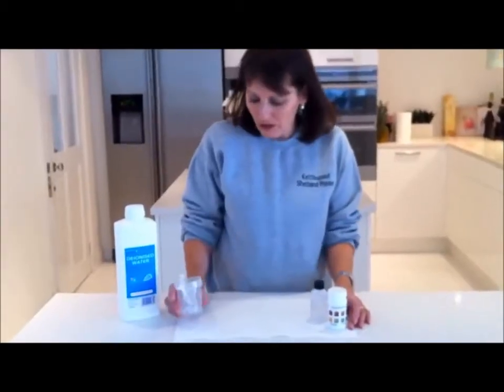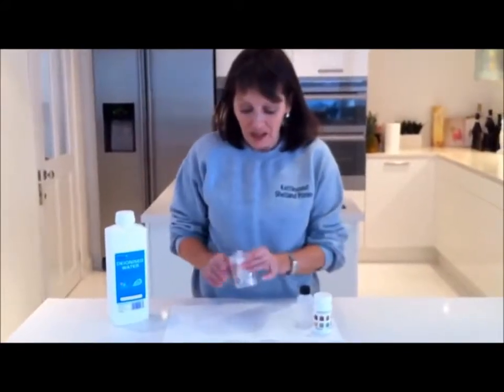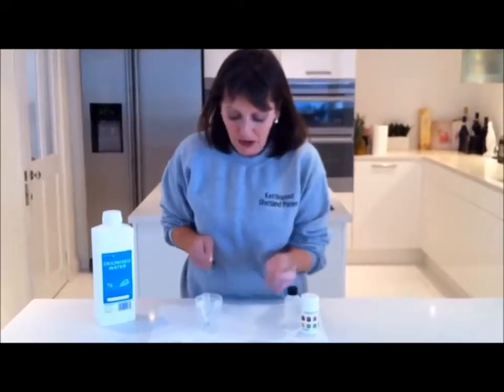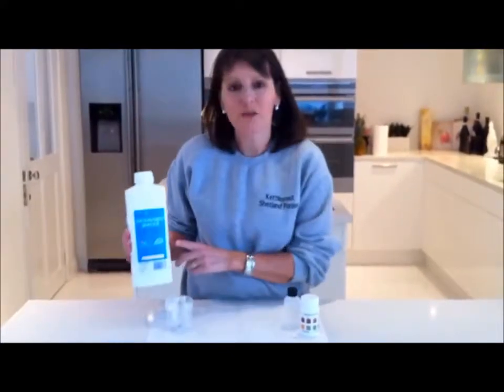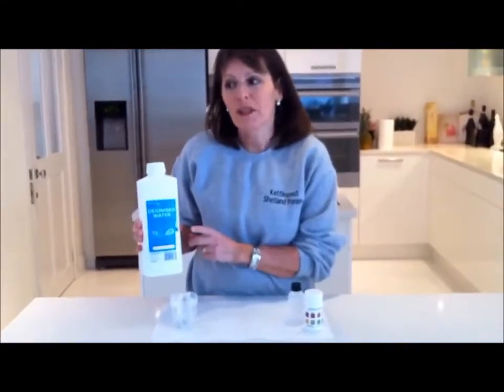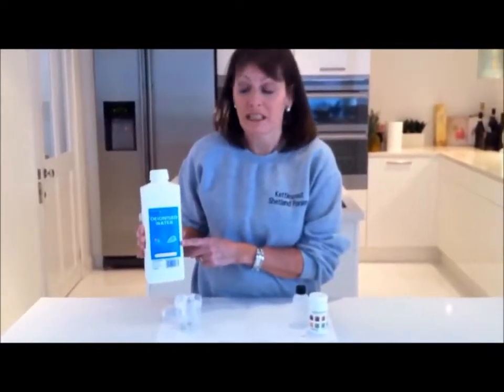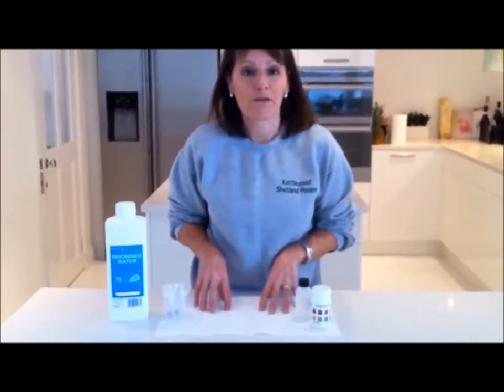Now we've done all the testing, you need to clean all your equipment for next time. I thoroughly wash everything in tap water and take the syringes apart for a good clean. I then rinse them in deionised water because any tap water residue could affect your result reading. I got this from the range — it was only about a pound a bottle. Then I just leave everything to air dry on some kitchen paper, ready for next time. I'll probably test again this evening now we're at the 85% point.